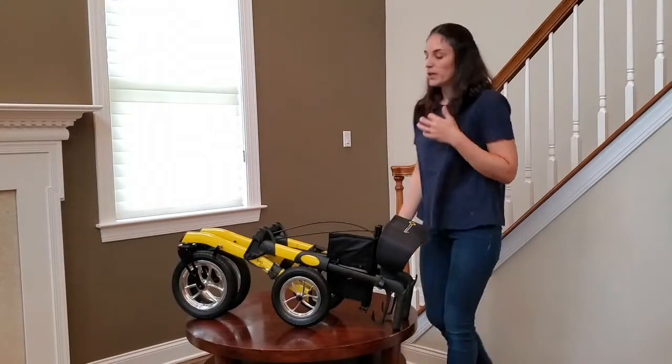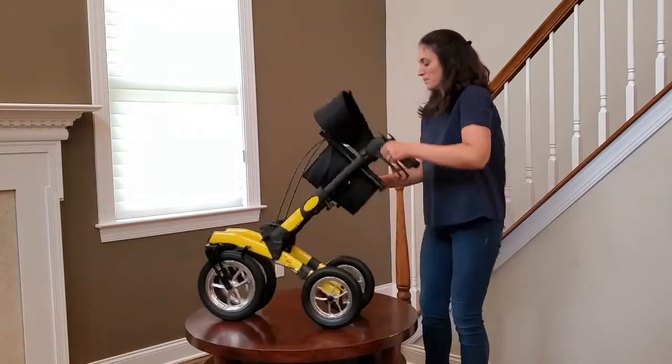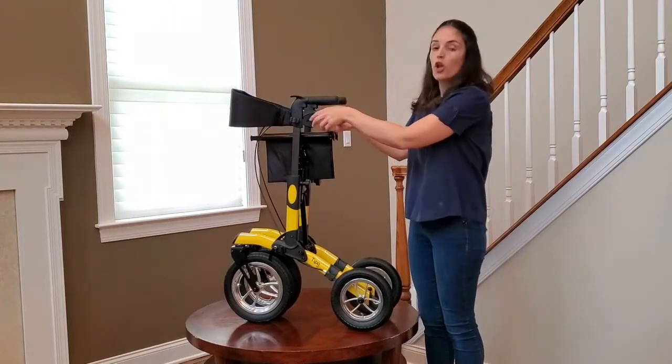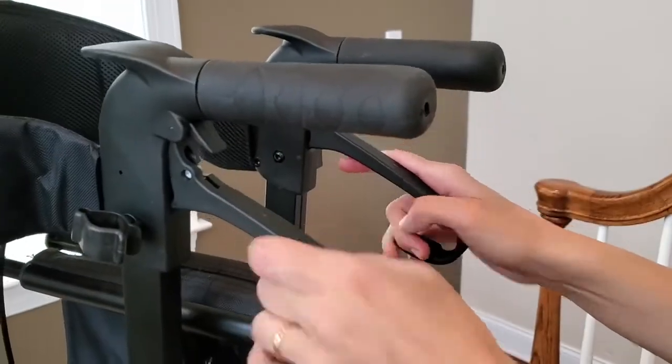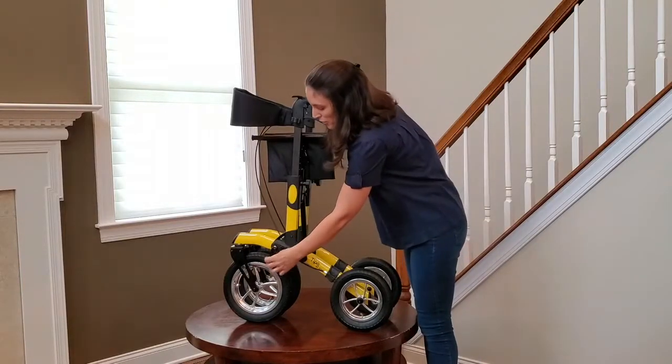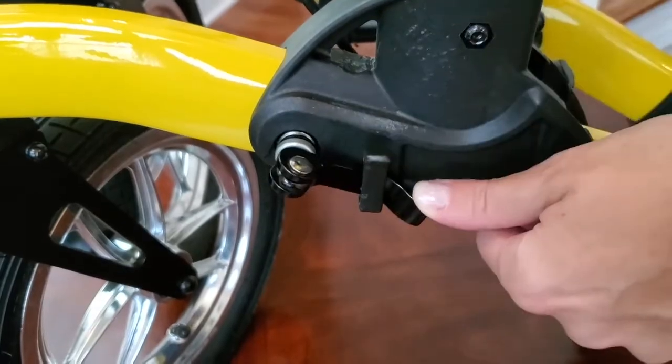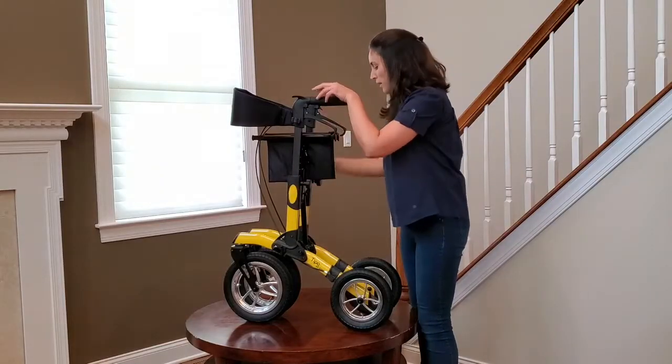To start the assembly, you're going to lift the handles up. Once they are in the vertical position, lock your brakes and find this metal lever — pull it up and slide it down to lock the handles vertically. Do that on the other side.